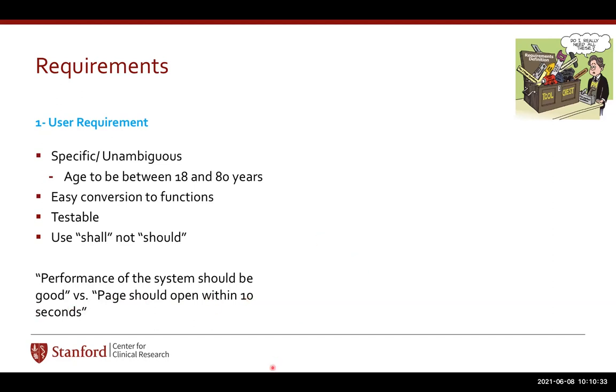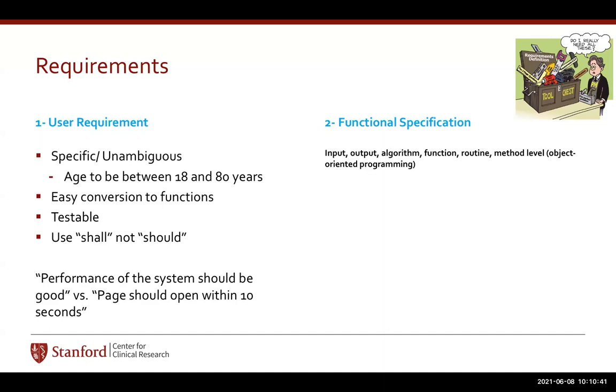Okay. All right. Then go to functional specification. As I mentioned earlier, with the functional specification, one should be able to really convert the input into output and write the code for that. If you cannot write the code, and some common people like me and you may be writing the functional specification, then you use the pseudocode.